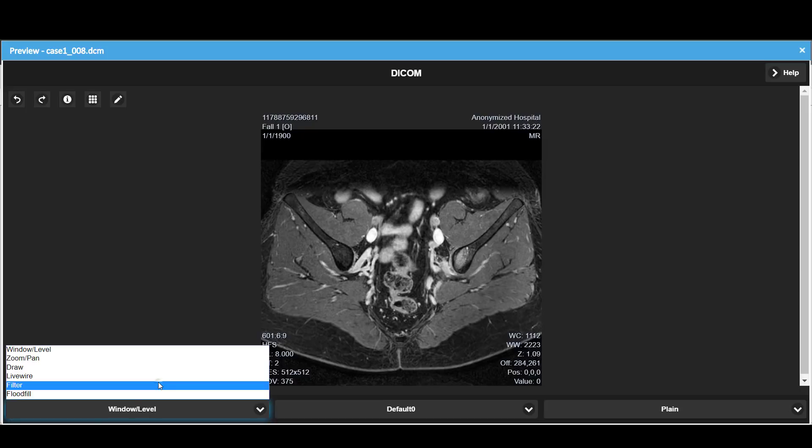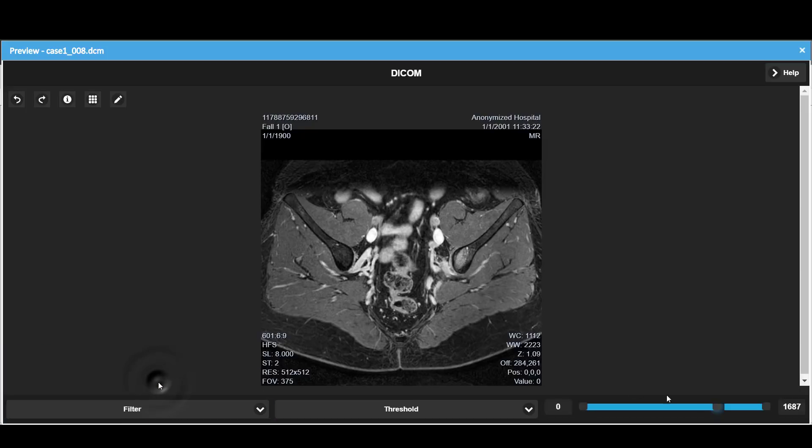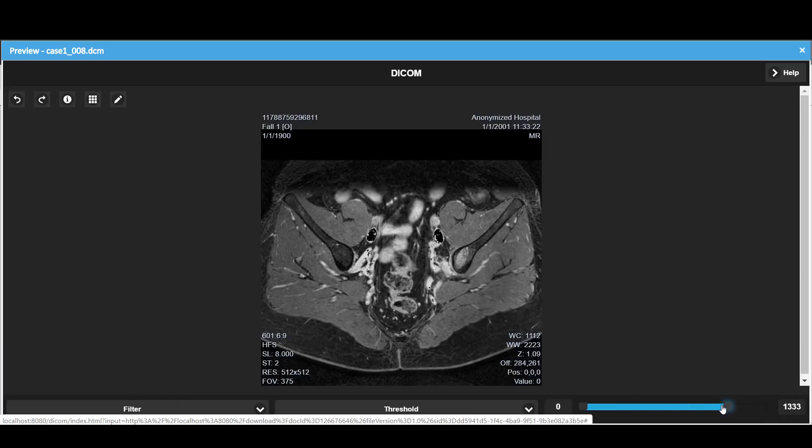The preview component also allows us to set a threshold filter to hide or highlight parts of the image.